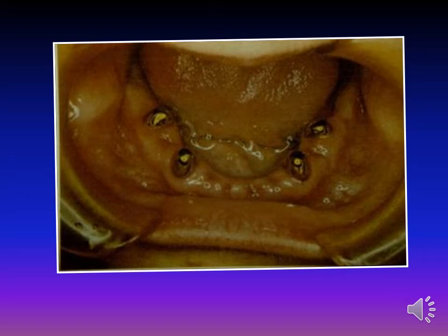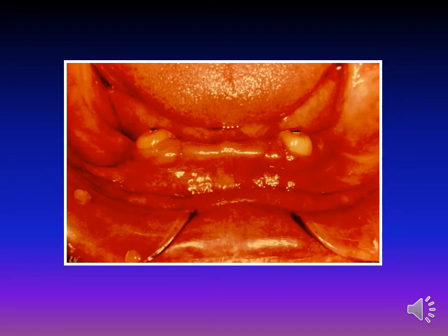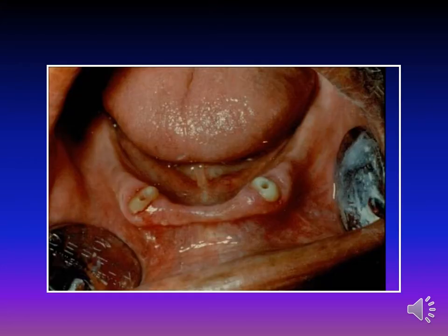This is abutment preparation with coping. This is a long coping and a short coping. This is with amalgam plug. This is preparation for abutment with coping and attachment.